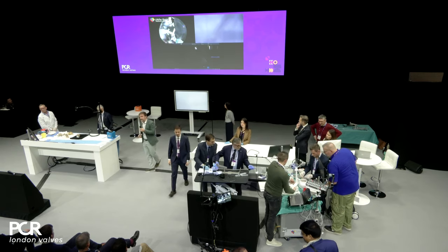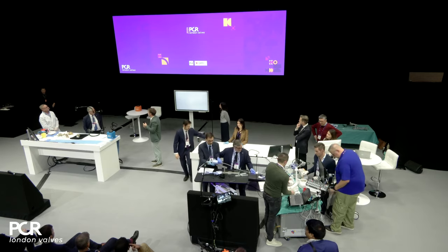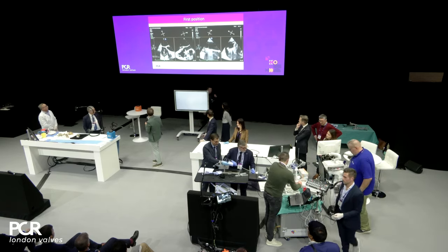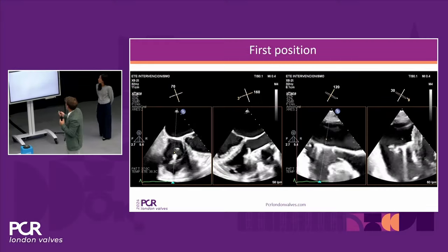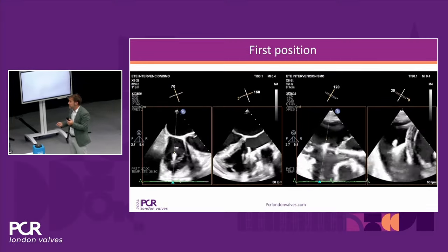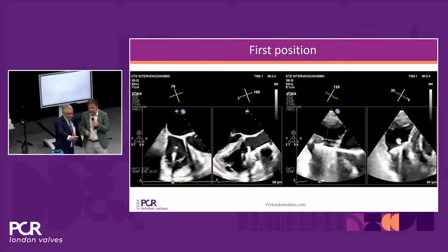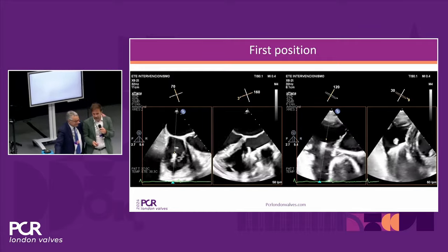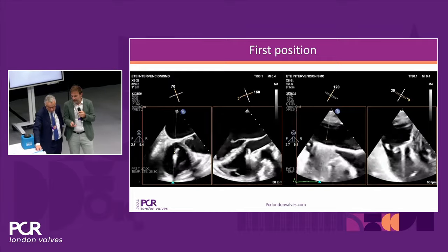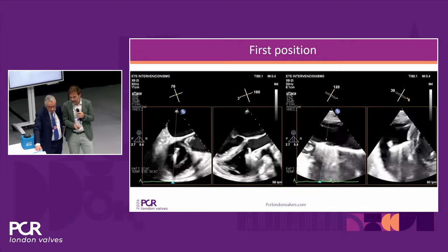The patient also had a past history of atrial fibrillation. So it makes sense to at least try a first attempt, trying to get a good catch in the anteroseptal. As we said, it's a really safe position. It's a position where you don't have anything to lose. I think it's a good idea when the strategy isn't clear to go there first, and after that you can decide. It's a good investment. And if you are not in the right spot, you can open it and go to another place.